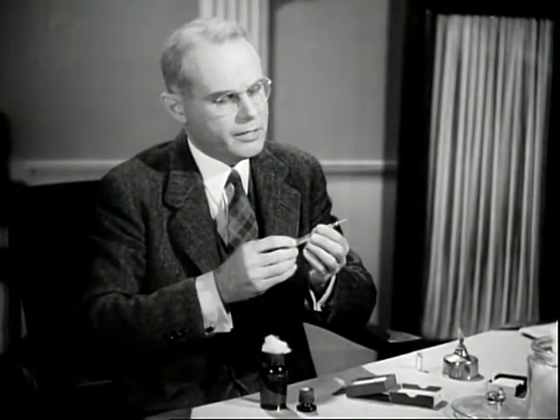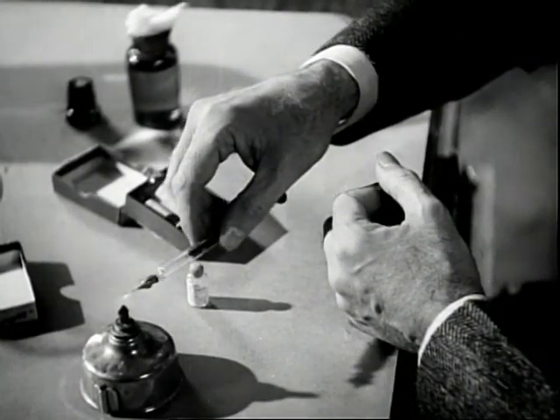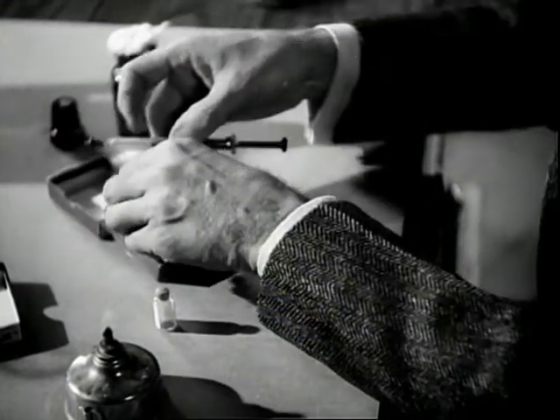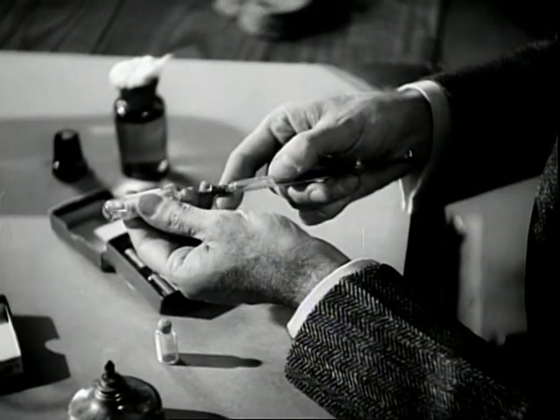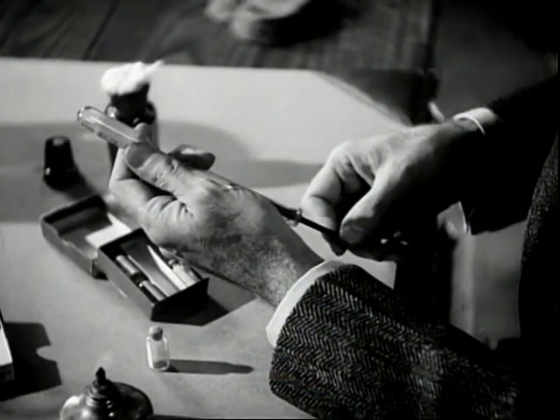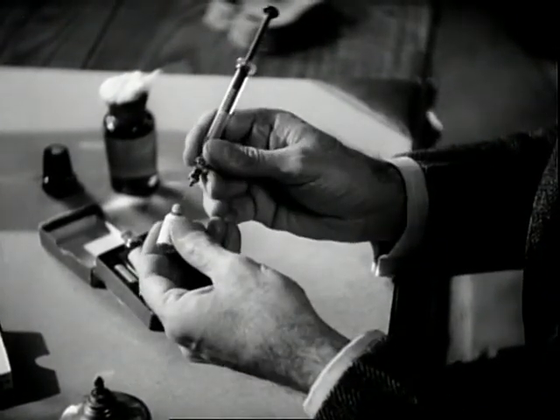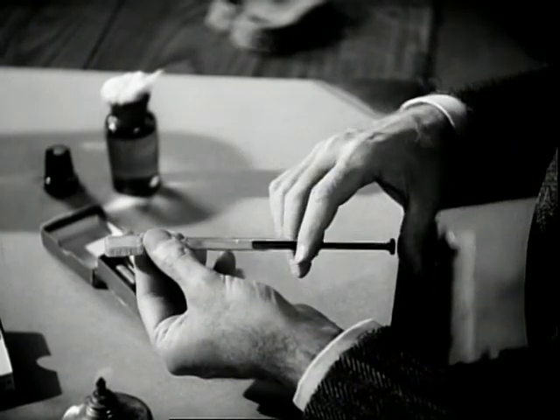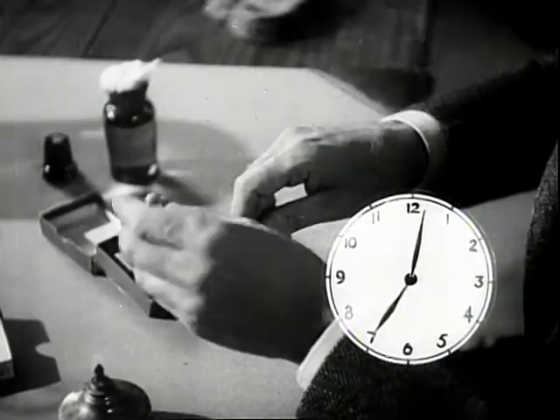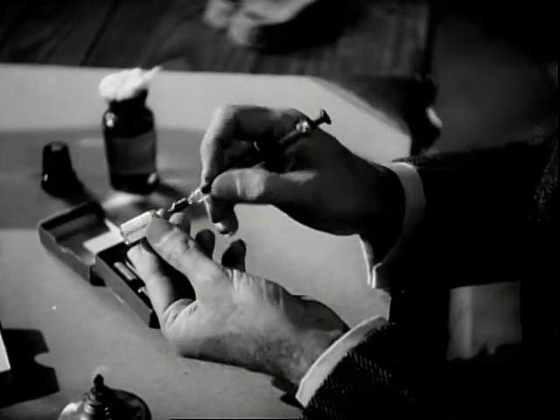Use a one cubic centimeter tuberculin syringe that has been sterilized. Inspect the needle for sharpness. Flame it to make sure that it is sterile. Draw the sterile buffered saline solution into the syringe, and transfer it with aseptic precautions to the bottle containing the tablet. Dissolve the tablet. Withdraw one-tenth of a cubic centimeter into the syringe.